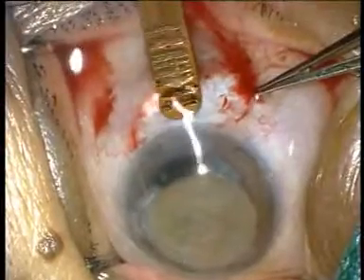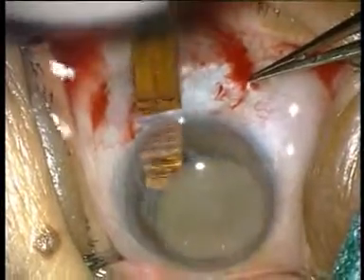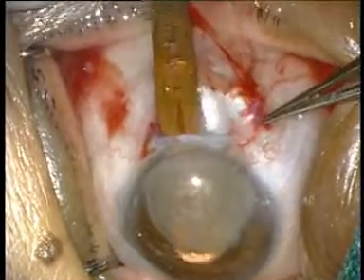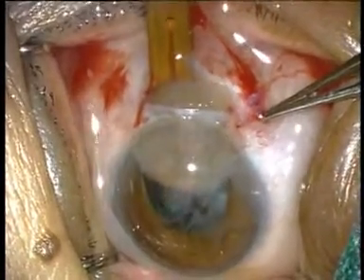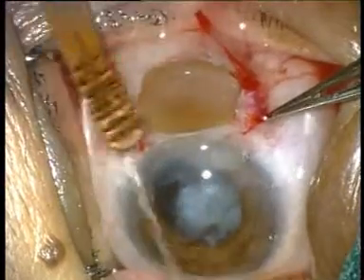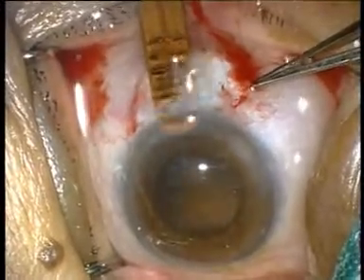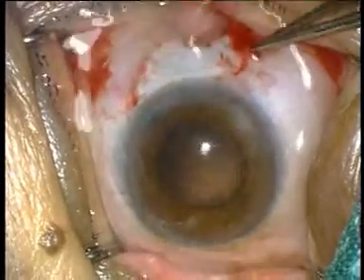A corrugated irrigating nuclear extractor is passed posterior to the nucleus, placing the tip beyond the distal pole. Gentle lifting and retraction with the cannula, plus opening of the external foramen with gentle downward pressure from the heel of the cannula, facilitates nuclear delivery.